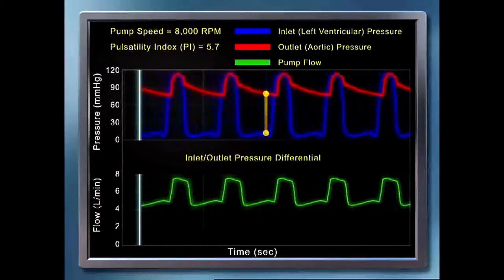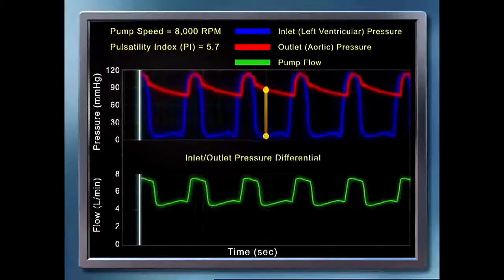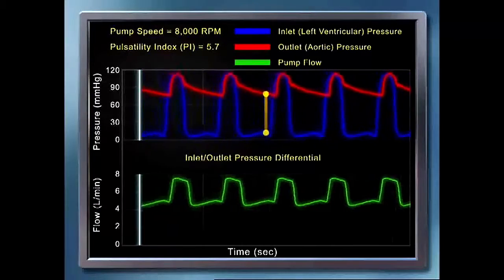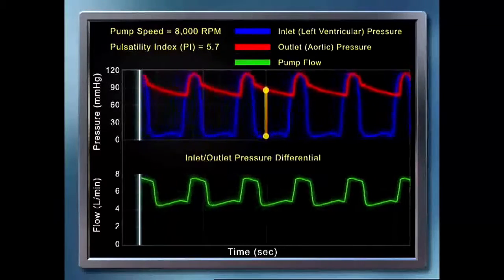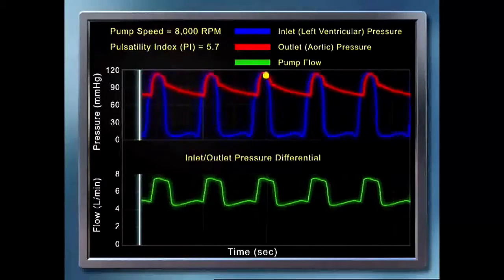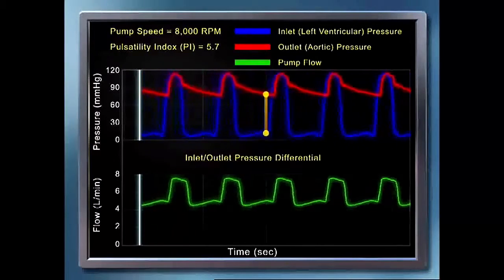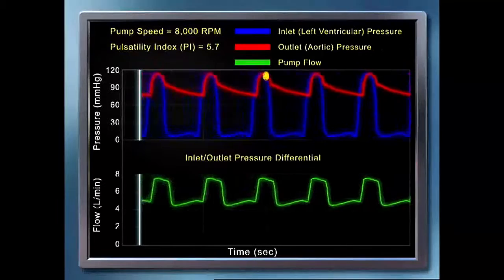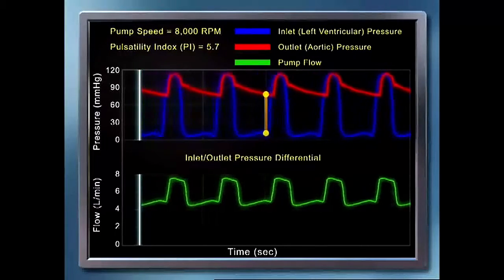As can be seen, this difference varies over the cardiac cycle, with the largest difference occurring in ventricular diastole and the smallest pressure difference occurring during ventricular systole. For a given pump speed, in this case 8,000 RPM, the differential pressure defines what the flow through the pump will be at any given moment.